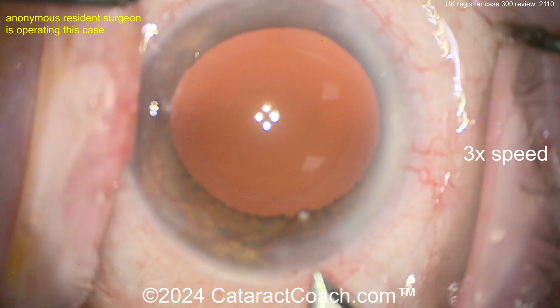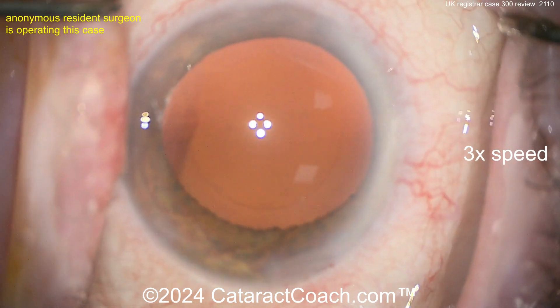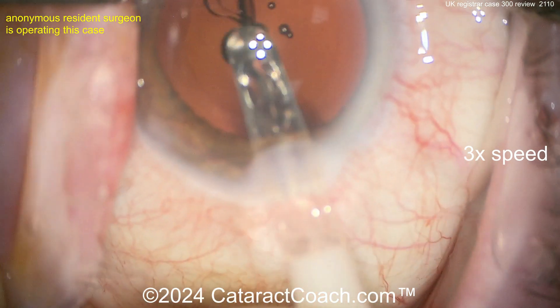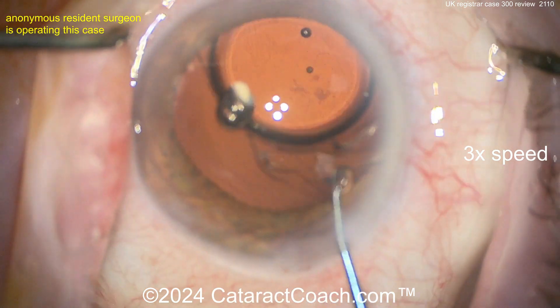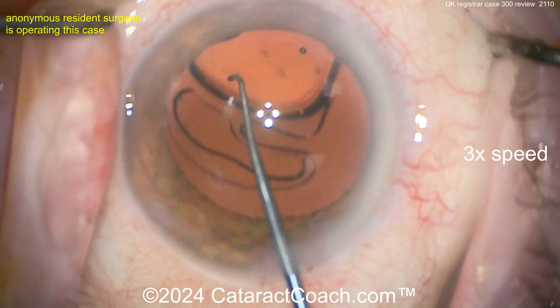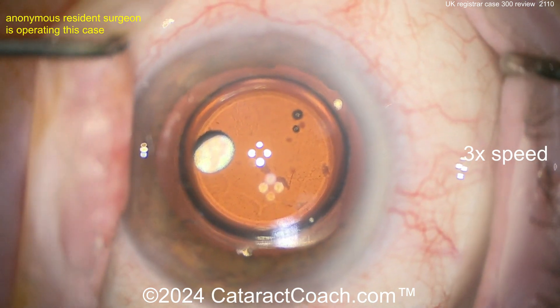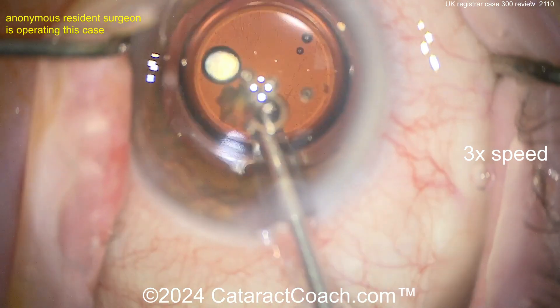There's slightly enlarging the incision. Here comes the lens — looks like a single-piece acrylic lens of some design. Getting that into the capsular bag, beautifully done. Obviously you've got great hands.